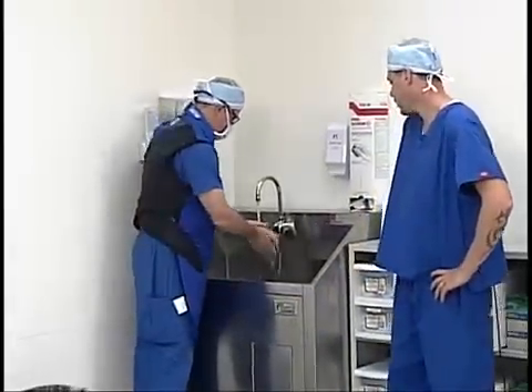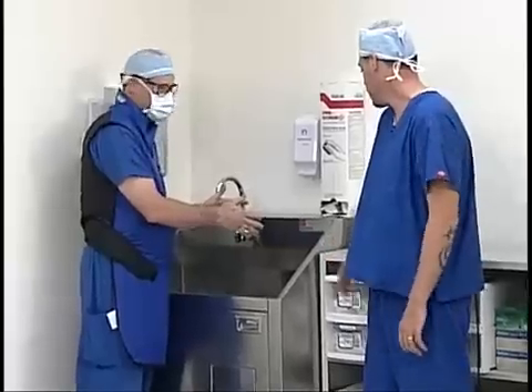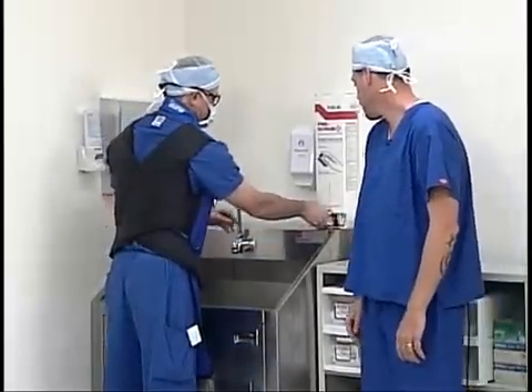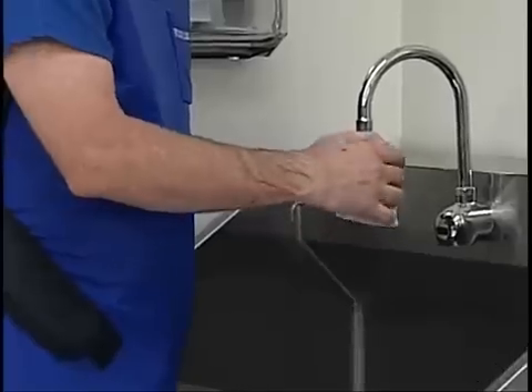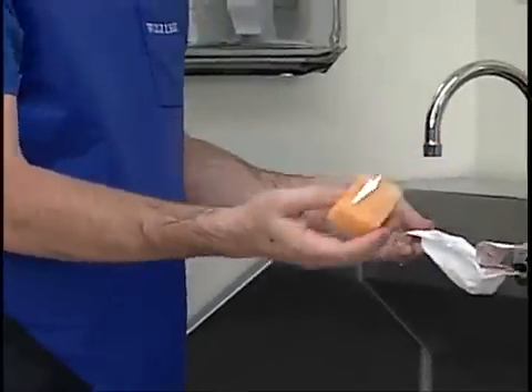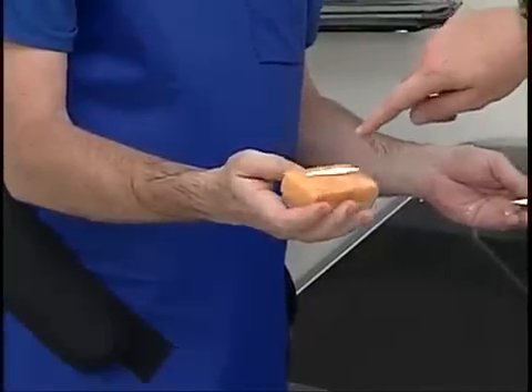The first thing Scott's going to need to do is get his hands wet at the sink. Once he gets his hands wet he can go ahead and grab a scrub sponge and open it up. Inside, the contents are going to consist of a scrub sponge and a fingernail cleaner. That fingernail cleaner can be used if you have dirty gunk underneath your fingernails that you need to scrape out.